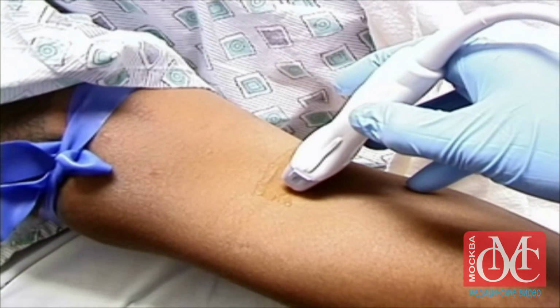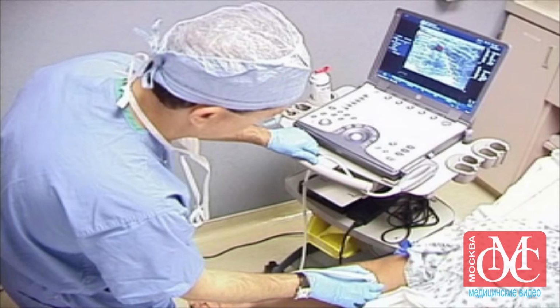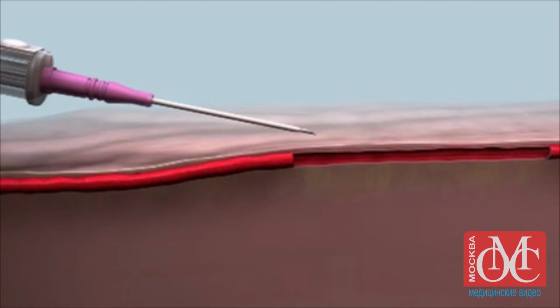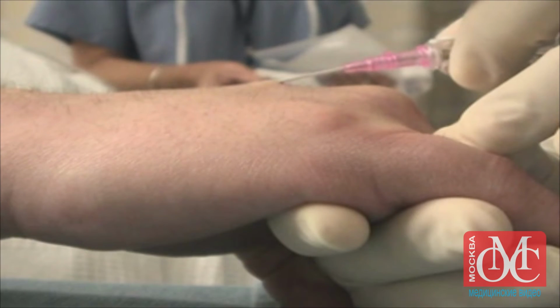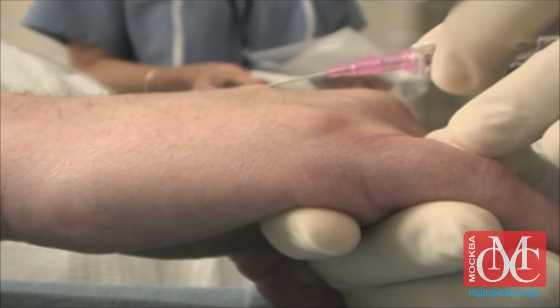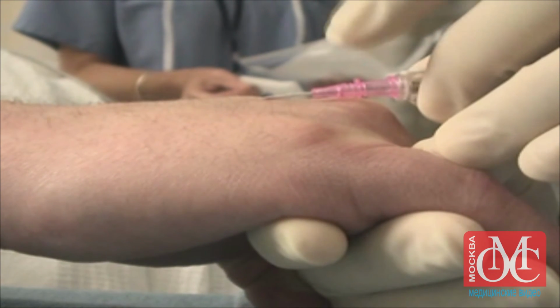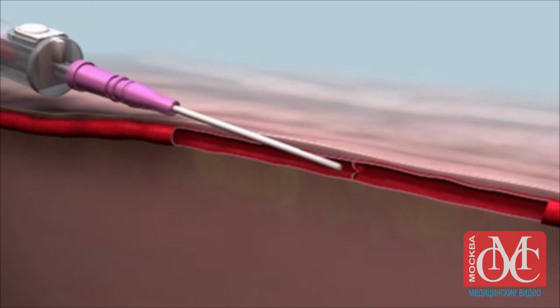These have been shown to improve the success rate of the procedure and to reduce the amount of time needed to perform it. Blood might flash back into the chamber if the tip of the needle has entered the lumen, but the cannula has not yet entered the vessel lumen itself. This problem can be avoided by reducing the angle of the catheter and advancing the needle a few more millimeters into the vein. A valve within the vein may prevent advancement of an inserted catheter.